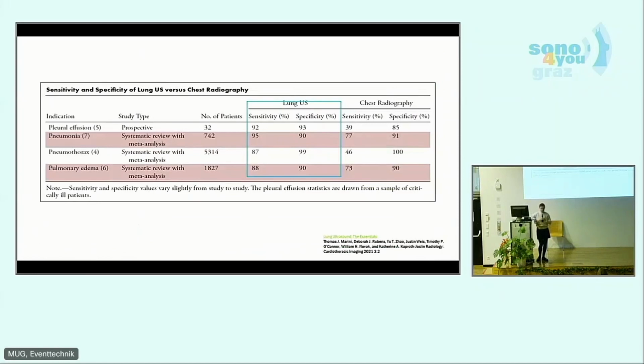We can do portable radiography. Our radiology technologists go all over the intensive care units, all over the hospital, and try to do these radiograms in really, really bad conditions. I don't know, have you seen what radiography in an intensive care unit looks like? The one we saw was the perfect, the best option, the best conditions possible. It's usually not like that. We don't see anything. We can see maybe where the lines and the tubes are, and all of these questions are really, I don't know, maybe.